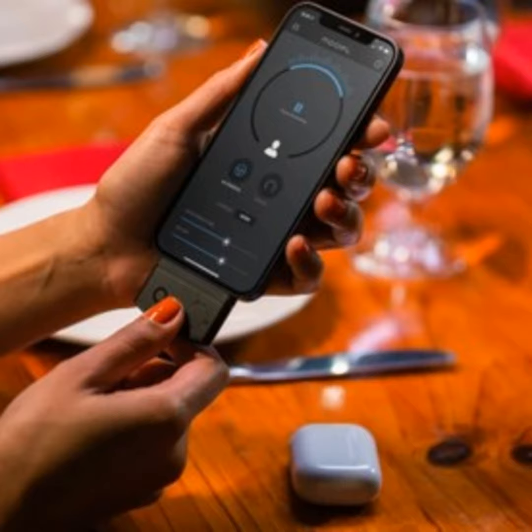Well, we're streaming audio. So just like any other audio playing from the phone to your AirPods Pro, whether that's music, podcast, you're watching a video, when one piece of audio is streaming and another one comes in, Apple disables one in order to get to the other. So you can't have two sources of streaming audio going into your AirPods. So it would disconnect, I guess, the Noopl function to be able to let you answer the phone. Exactly. It would pause the stream while that phone call comes in or whatever that other interruption is. And then when you want to go back to talking to somebody, you can just restart Noopl's stream.